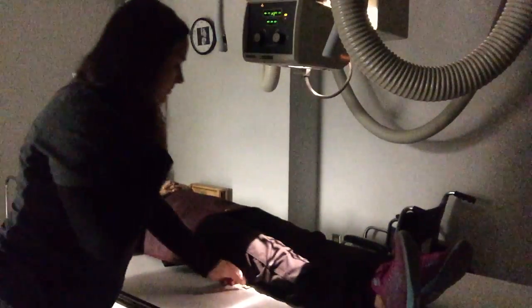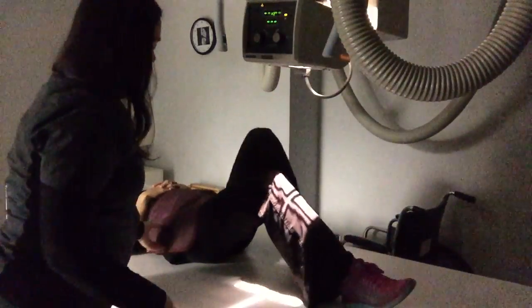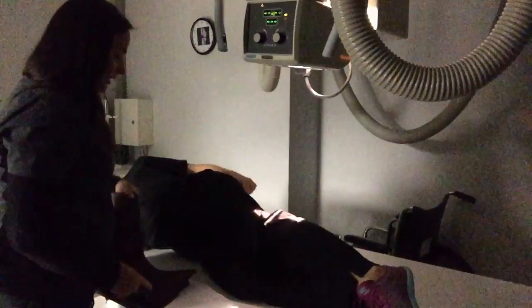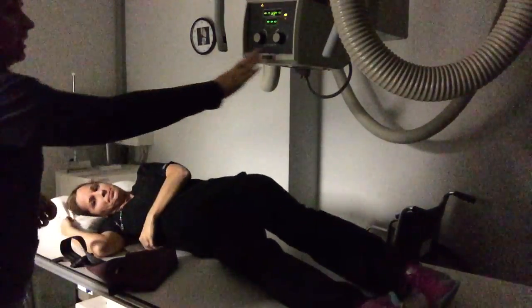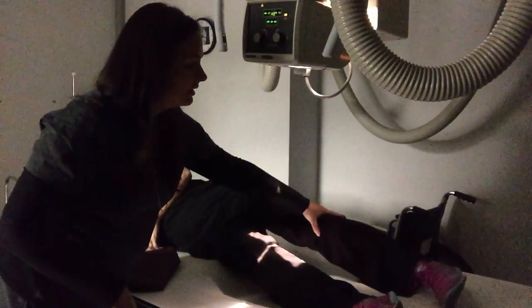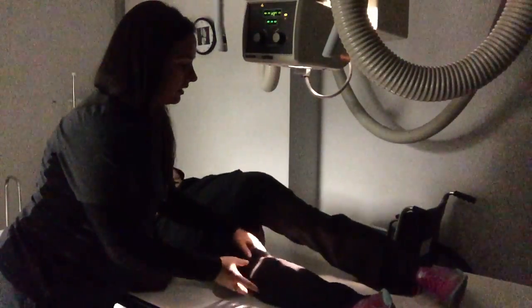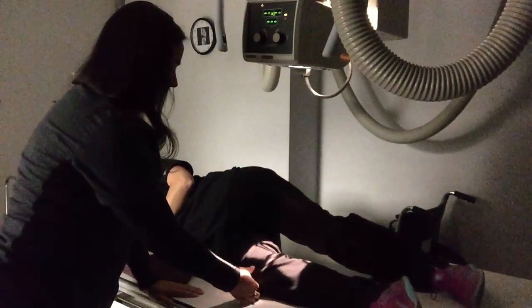And next we're going to do the lateral projection. So I'm going to move my marker out of here. And I'm going to have her roll onto her affected side, which is her right side. All right, there's a lot of different ways you can get their knee lateral, but we're going to go for your practical with how Merrill's has it demonstrated, which is with the top leg or the unaffected leg straight and the affected leg bent at 20 to 30 degrees and closer, right out here in front where you can see it. So I'm going to move around here and get centered right over her knee joint.